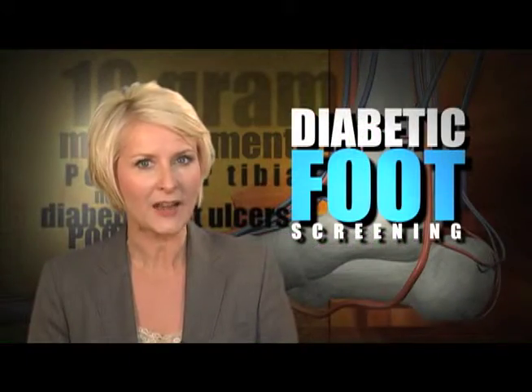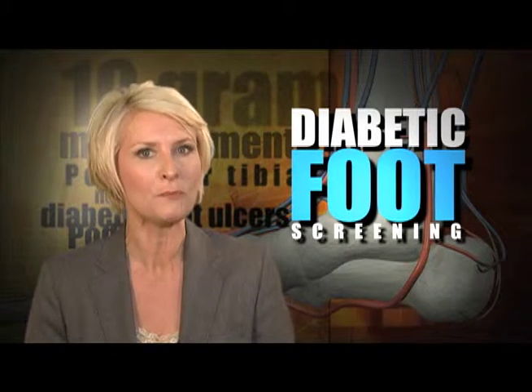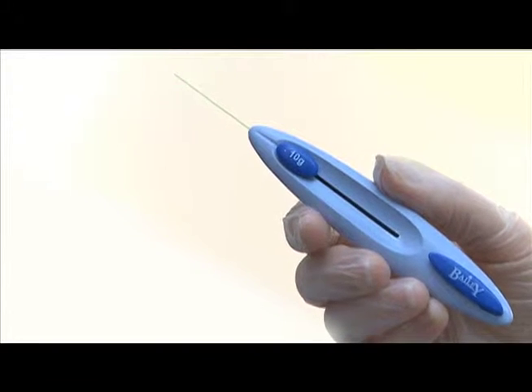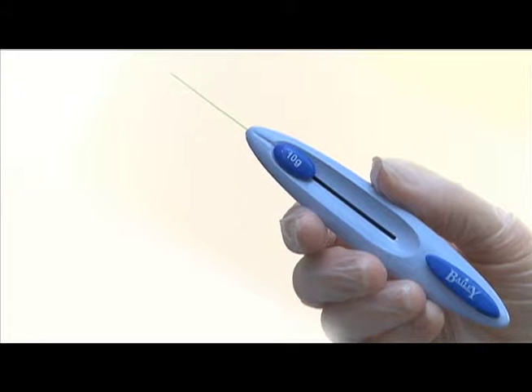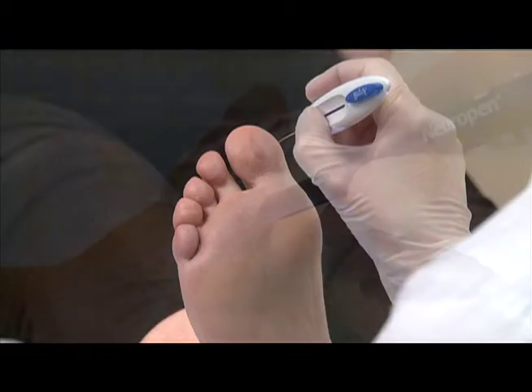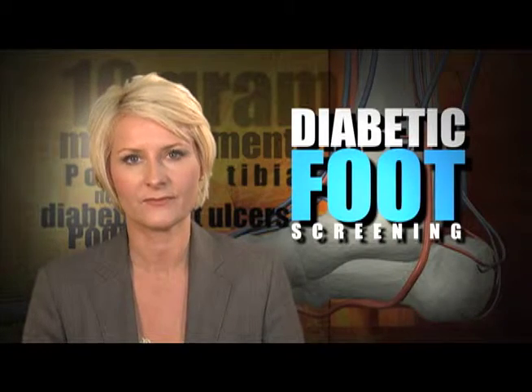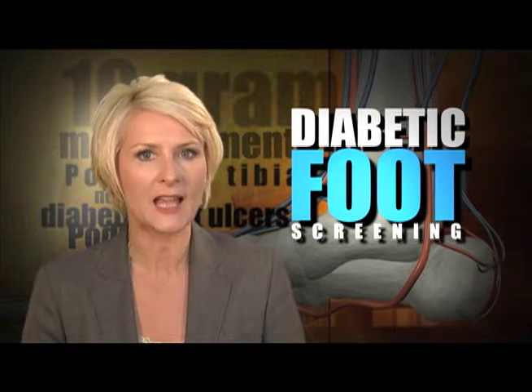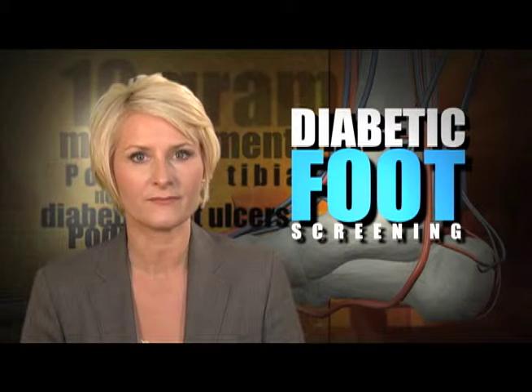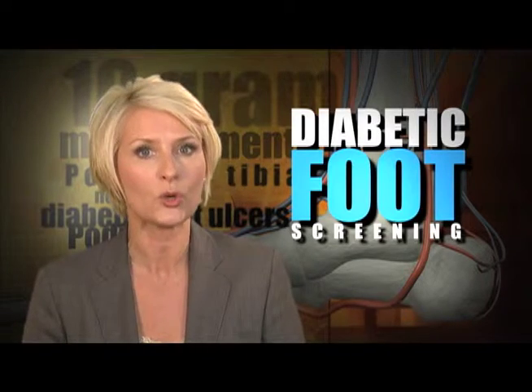The next test we carry out is for diabetic neuropathy. This is to enable us to easily check if the patient's protective sensation is intact. For this test, we use a 10-gram monofilament. It's important that you only use reputable makes of monofilaments. This will ensure that the information you are collecting is accurate. The monofilament must be rested after use and replaced regularly, approximately every 6 months. The advantages of this test are its simplicity, accuracy and low cost.